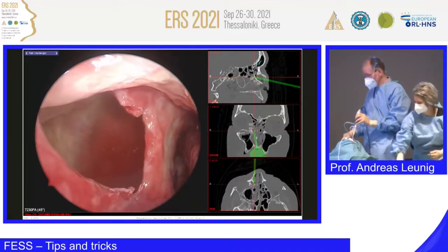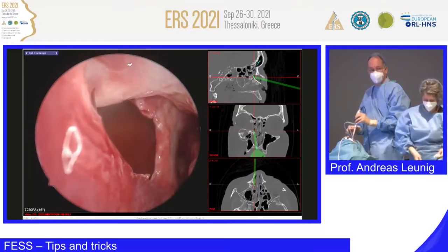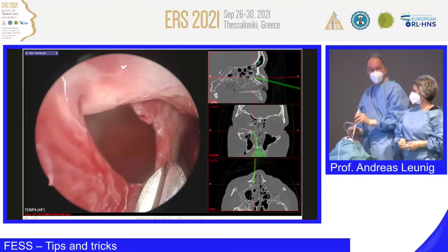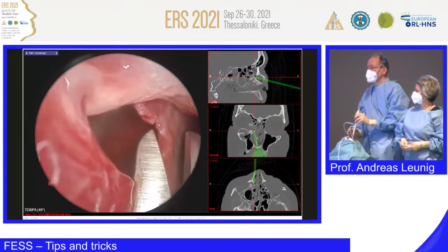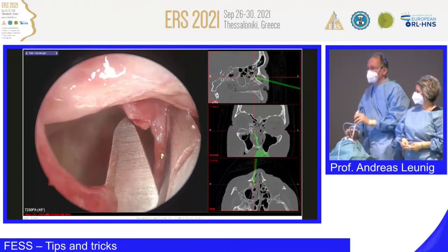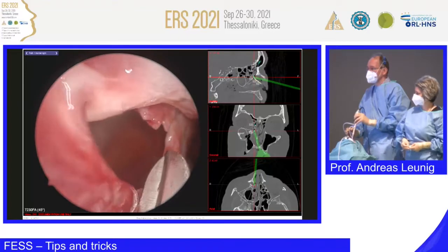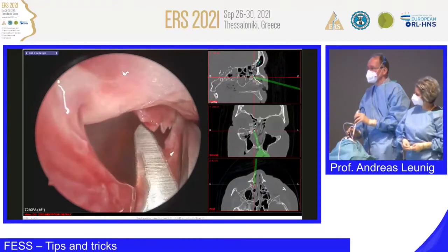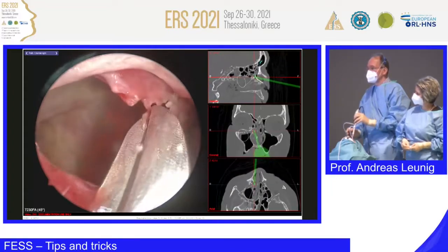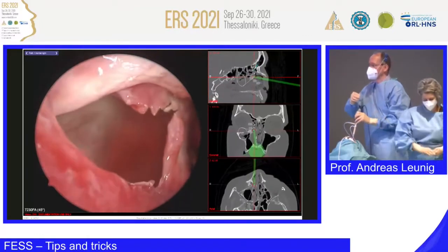And this is what I learned from my friend Hans-Rudi Briner, because I had a case, and I will show the case tomorrow in the first sessions when I'm talking about the concept of FESS with a number of video clips, and hopefully you are coming. I had a patient where I tore a lot of mucosa by opening the maxillary sinus, and then I changed my technique as well. You can make a clear cut here, so you avoid tearing mucosa in this area, and you leave the mucosa here at the roof of the maxillary sinus intact. So please, the cutting Plexi again.